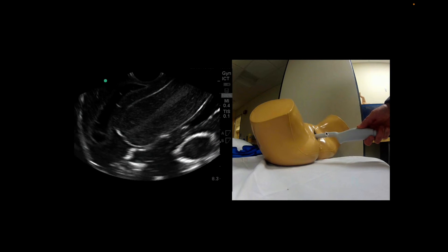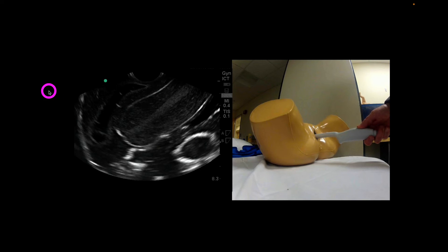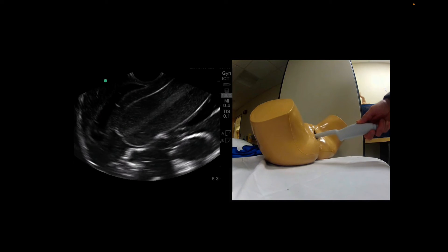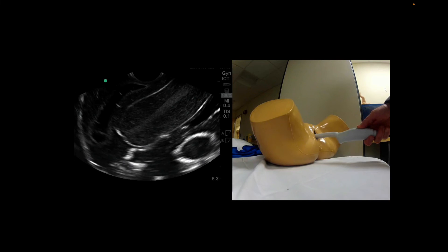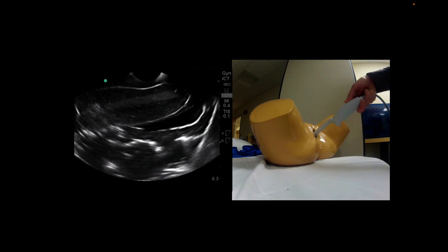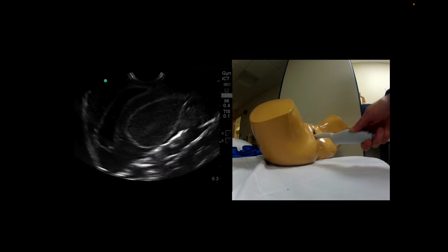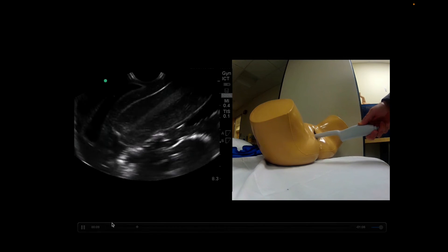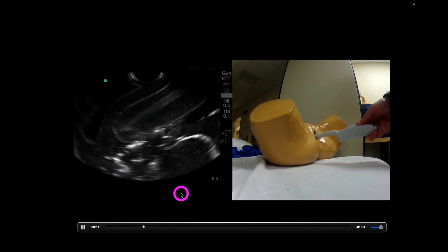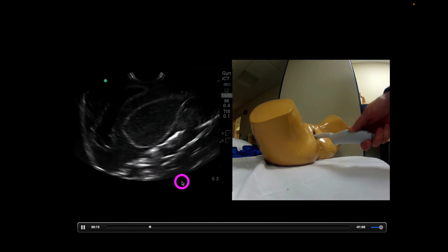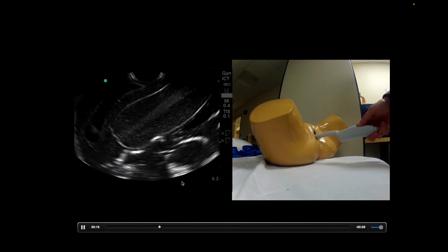You'll notice there's a bit of a ledge here. We're going to start with the handle facing down, which gives us probe marker up. This direction is towards the anterior abdominal wall, this is towards the back, this is cephalad, and this is caudad over here. When doing this, make sure that you are adequately fanning anterior to posterior and also side to side to get a full view of that uterus on this phantom simulator, as well as attempting to find the ovaries.